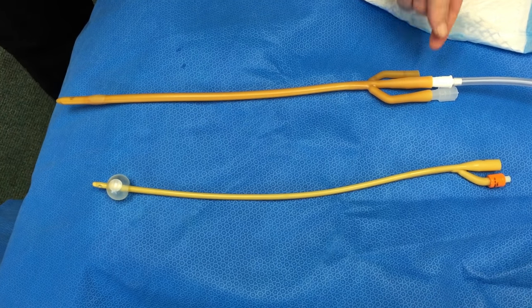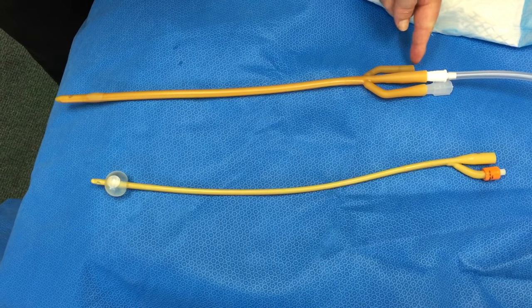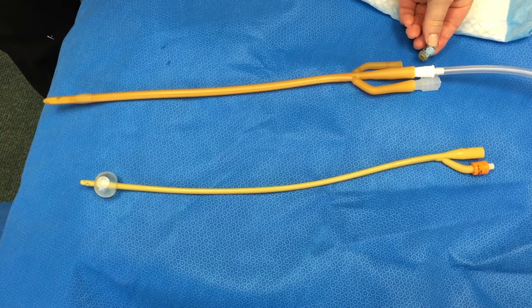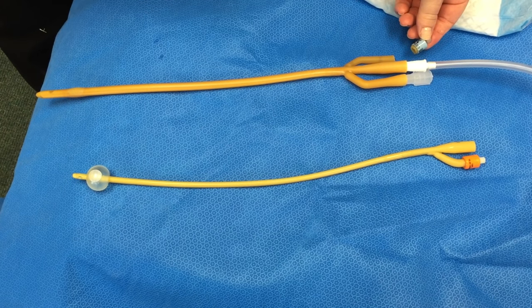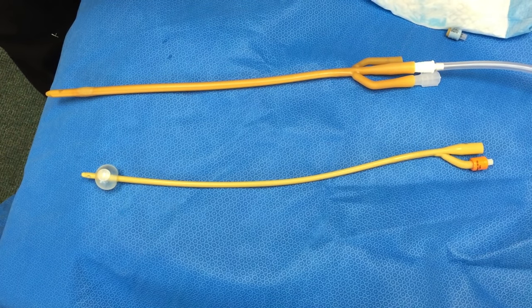Once again, to reiterate the instructions: you're going to identify the balloon port. The balloon port will be the one that has the colorful plastic applicator. And you're going to cut the tubing which connects the balloon port to the remainder of the catheter.